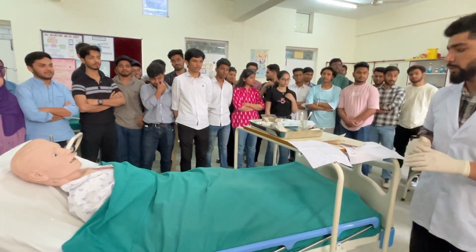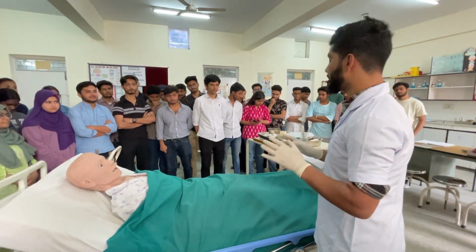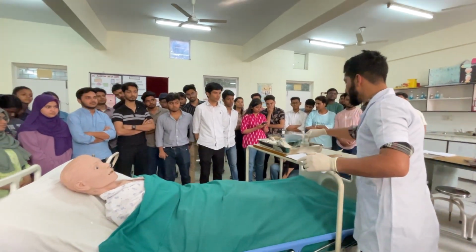Now we are wearing gloves. Okay, now we are following the procedure. So after that, the cannula with connecting tube, I will tell you.